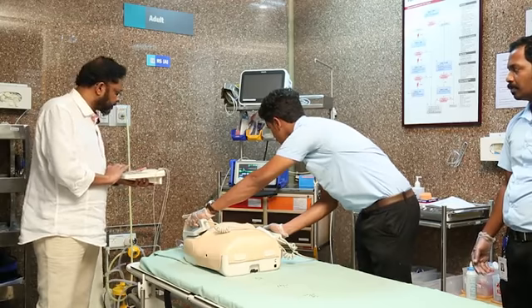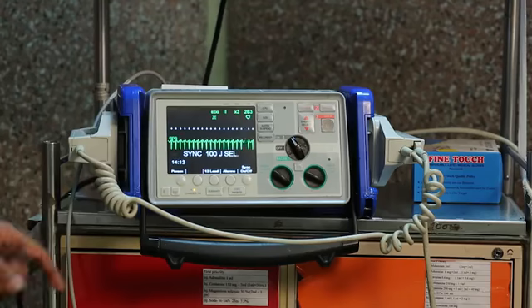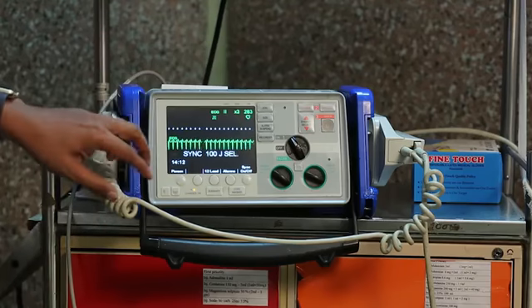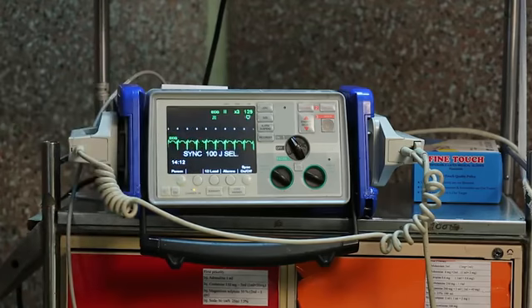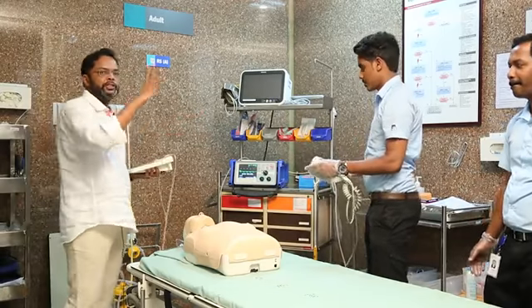Now the shock is delivered, and we see what happened to the rhythm. Yes, the rhythm has converted into normal, and the cardioversion is effective.